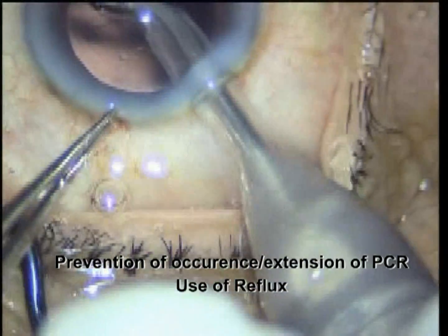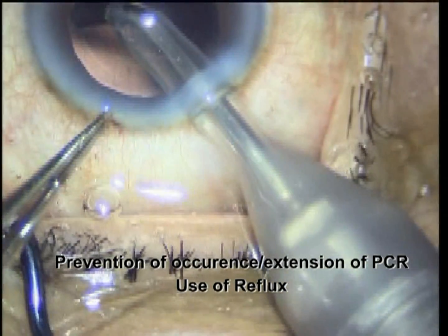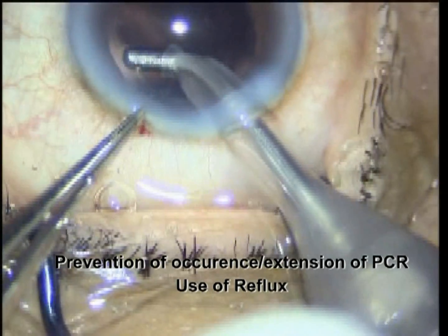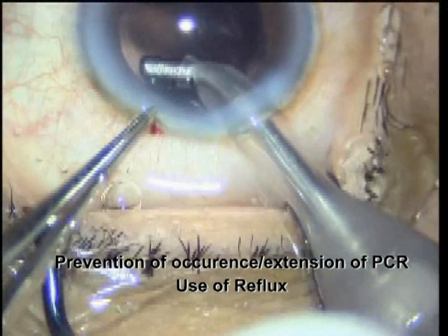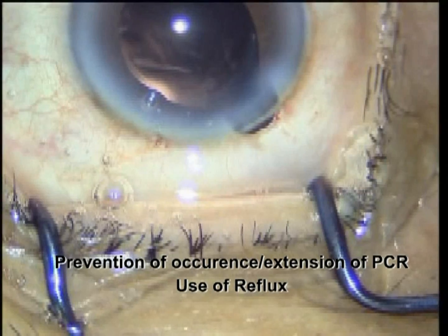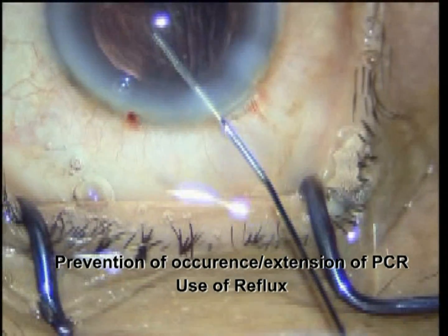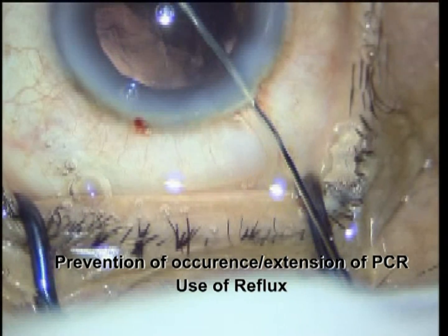How can we prevent occurrence or extension of PCR by using reflux? Here the posterior capsule was caught, reflux was used, and thus the extension of PCR was prevented. One has to use reflux to prevent occurrence or extension of posterior capsule rent.